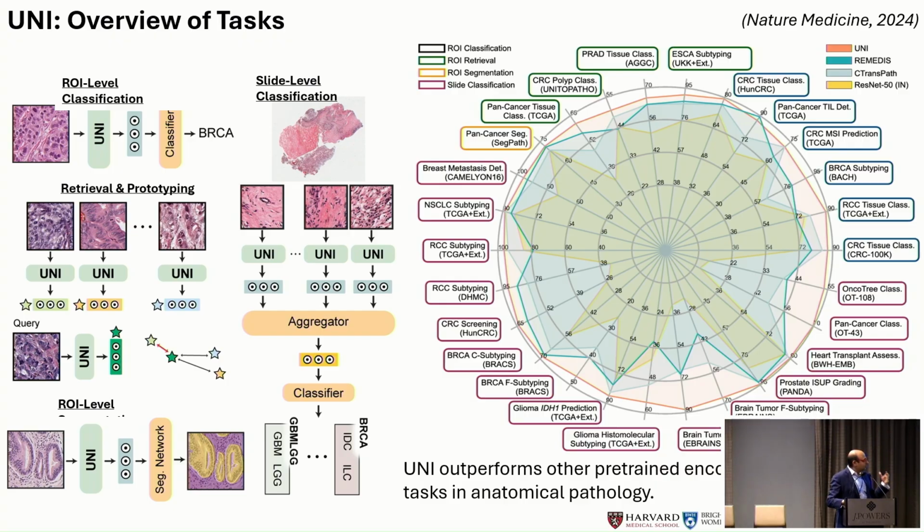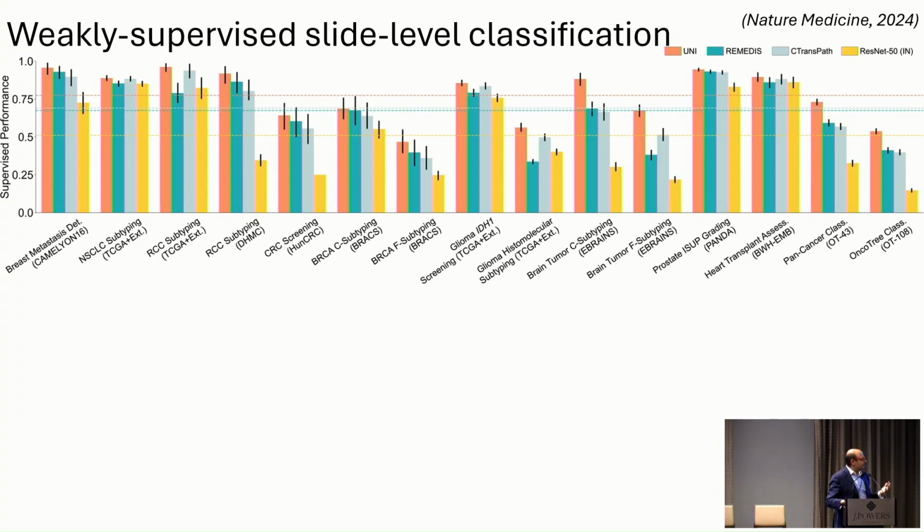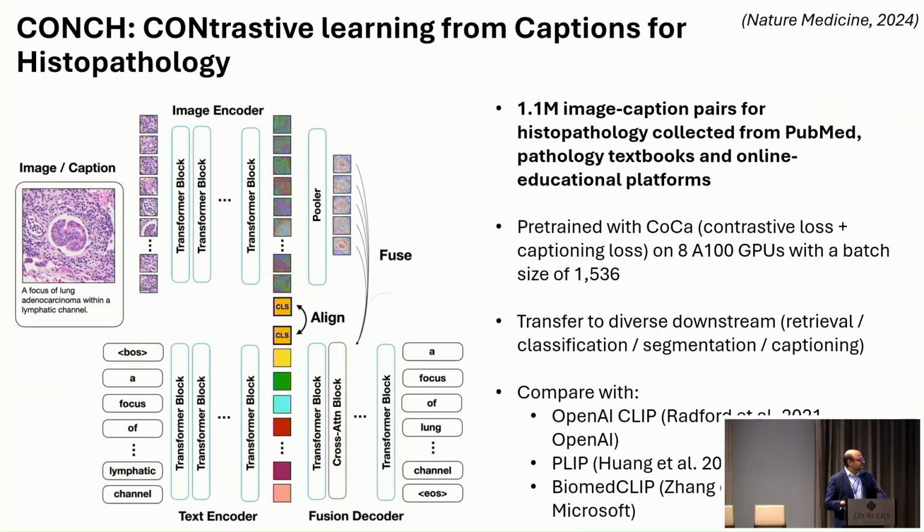So we also focused on tasks like, can we classify all of the OncoTree codes within the OncoTree system using pathology images. Since then, we've expanded this substantially to include a lot more data in pre-training, but also the downstream assessment. We have much better tasks for it, both at the level of the slide as well as in a few-shot setting. And few-shot is very exciting in pathology because you don't really have a lot of cases for rare disease, clinical trials, and all these other interesting situations that exist in pathology.